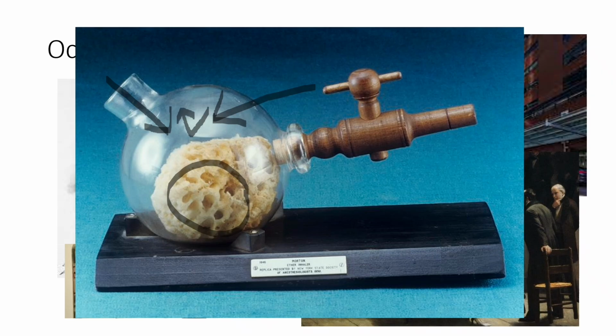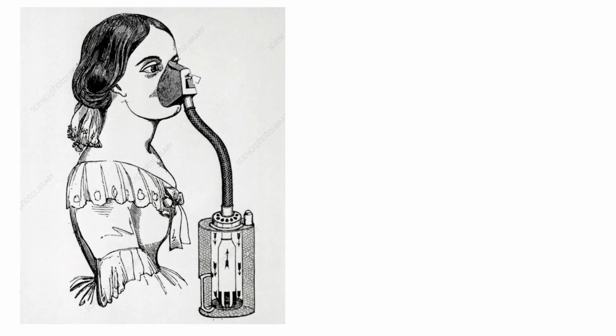Fortunately, the low boiling point of ether means that vapor is produced quickly and at a sufficient concentration to maintain anesthesia. However, this was a very rudimentary device since the vapor output was highly variable. This is an illustration of a chloroform inhaler used in the 1850s by the British anesthetist John Snow. The mask was made up of lead and molded to the patient's features. As the patient drew in breath, the air became impregnated with the chloroform in the chamber at the lower right.